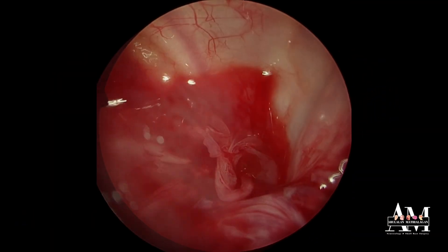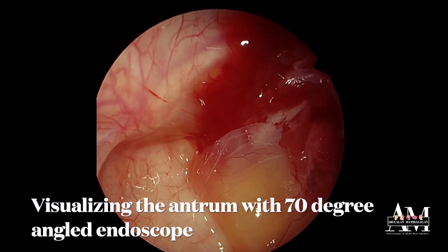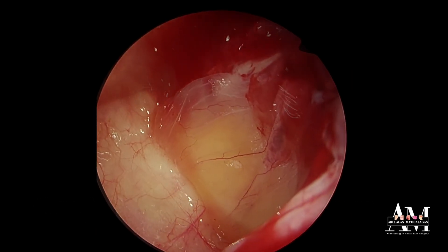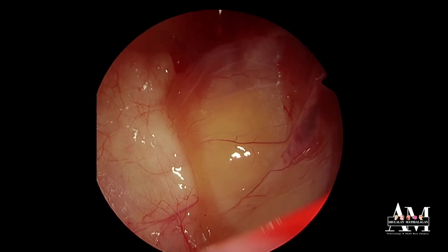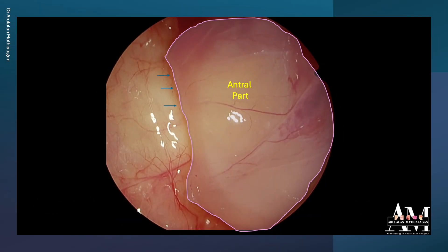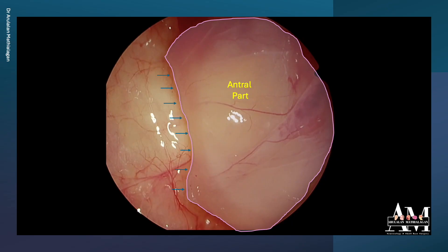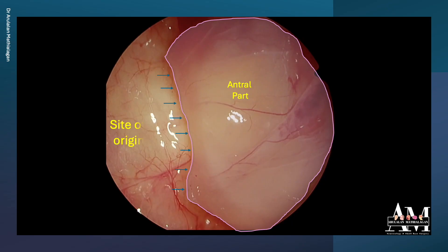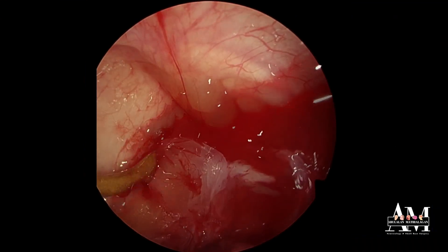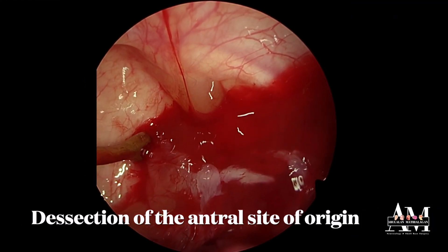We can visualize it with a 70-degree scope and we can clearly identify the attachment of the polyp, which is a broad-based attachment along the floor and the anterolateral wall. This is the site where the polyp is arising from, so this has to be clearly dissected off, otherwise we could end up with a recurrence.